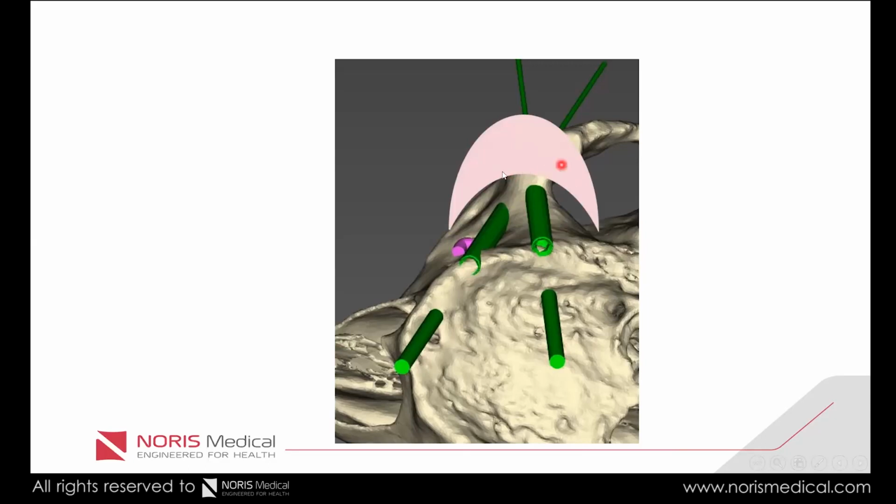Okay, so our view is like that. We don't see, but even if we raise the flap, this is about what we see. Don't forget that. Now it's a very nice model, but actually in life it looks like that. And we want to be able, even though it looks like that, to find the correct entering point.